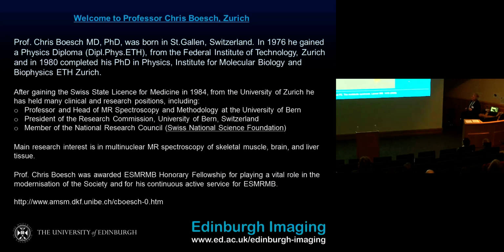Let's now go to the liver. We can use different methods. Imaging has been proposed as well as spectroscopy. Spectroscopy is today recognized as the gold standard, mainly because at very low concentrations of liver fat, imaging is generally overestimating the liver fat, mainly because of the magnitude character of an image, so you have no negative sign possibility. On the other hand, as soon as it goes to pathological levels, MRI has the advantage, is also reliable, and has the advantage that you see the spatial distribution of your lipids.